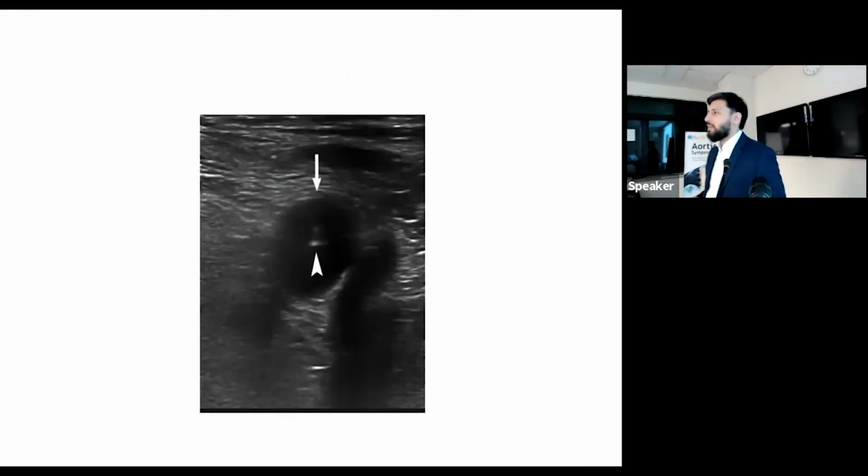This is just for arterial access. I put this in here. At the moment, we're doing all our endovascular aneurysm repairs with a surgical open cutdown of the groin. In the UK, I've done loads of percutaneous EVARs. We can actually close holes up to 18 French easily now percutaneously, which means that we can do an EVAR completely percutaneously. I tell my fellows in interventional radiology that whenever you're accessing the femoral artery, you should access it axially at 12 o'clock, because this is good practice for when you use closure devices. It's essential that your access is at 12 o'clock for a closure device.